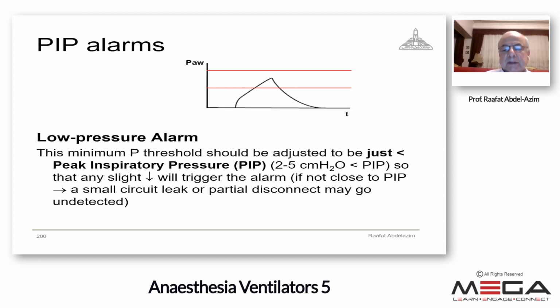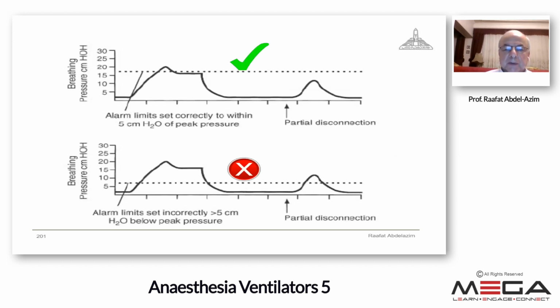This positive wave is due to the small tube, like also ventilating neonates. The small tube will give positive pressure, even if it is not in the trachea, but it is still connected to the ventilator. So the peak pressure will be positive, but below the usual value, as will be seen in the next one.